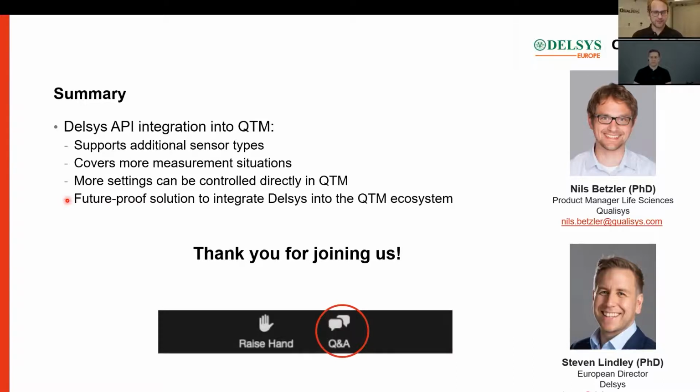I can see we already have some questions coming in here. One question is maybe best for you, Steven. Does the Delsys API require the use of the Trigno control utility while collecting data?